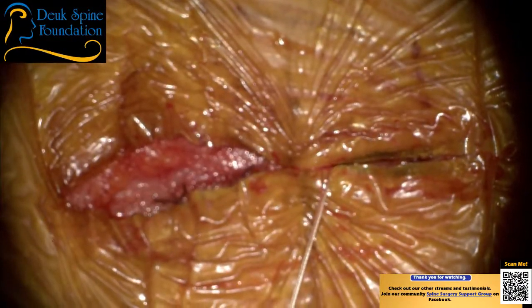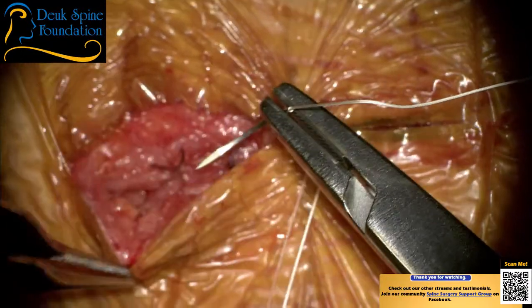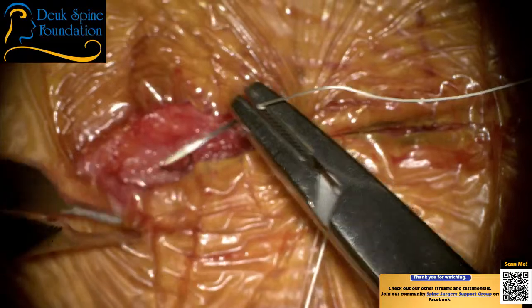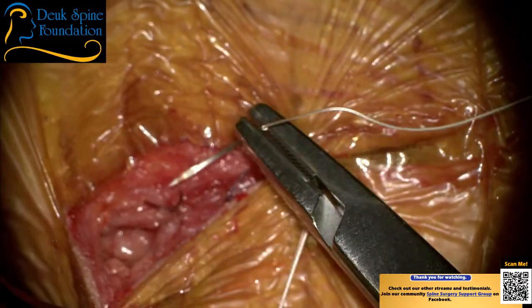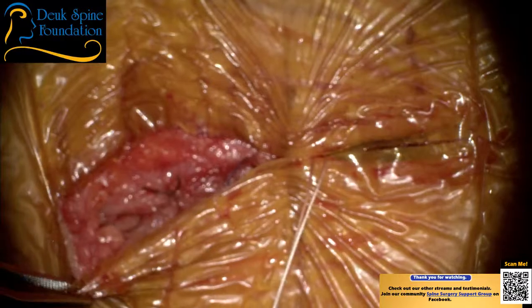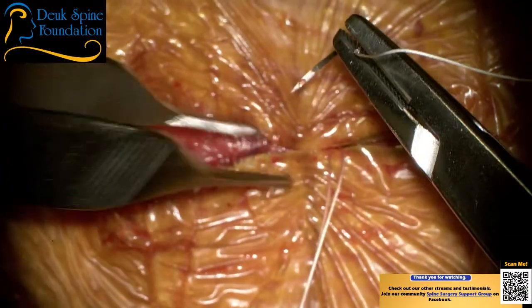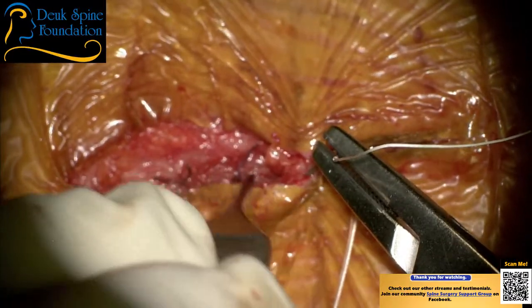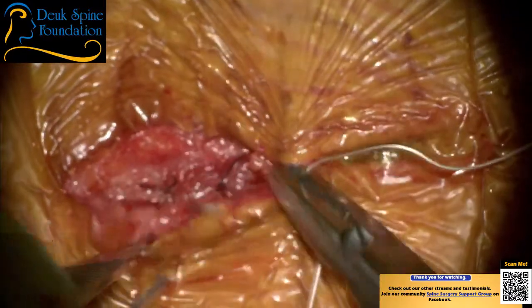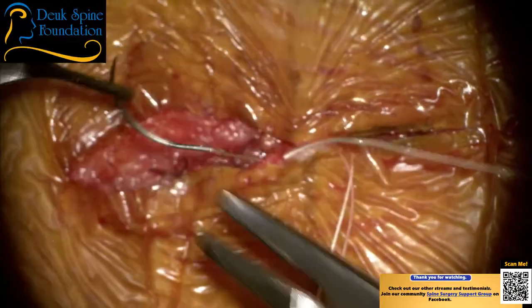Let me have the pop-offs, because these aren't pop-offs, right? You have the white ones, one more? Yeah, but we need more, if I'm popping them off. You understand? How many do you need? Well, normally to close a wound like this, I need a lot. I need 10. Yeah, but these get very expensive.